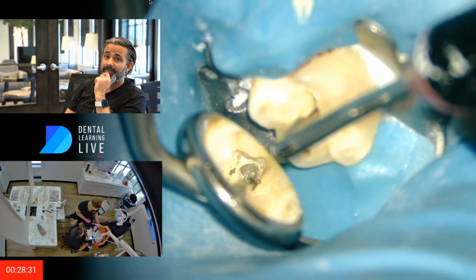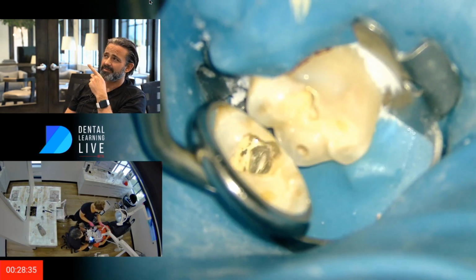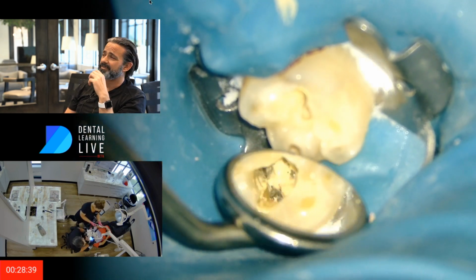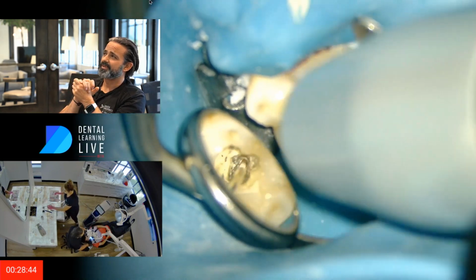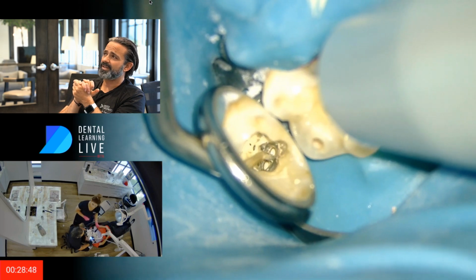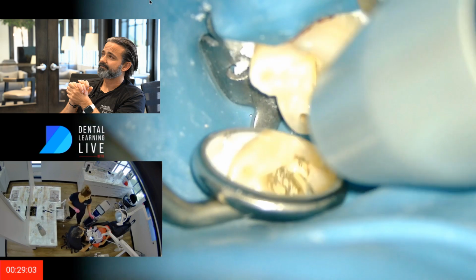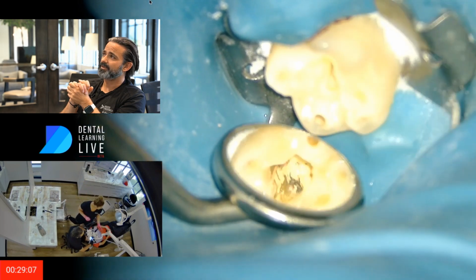Gonna do a little down pack. I don't push terribly hard in these things. I mean, in a case like this, really the instrument's sort of hitting the walls and not putting a lot of pressure because of the size. And then I'm just using a heated element. I'm going to the mesiolingual.